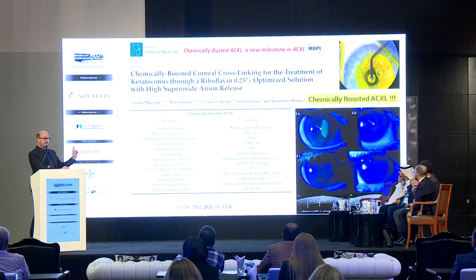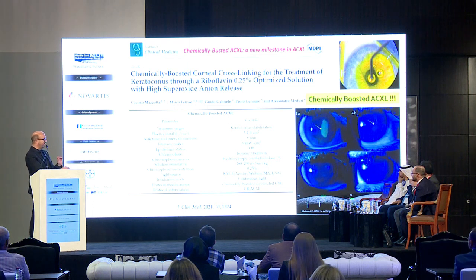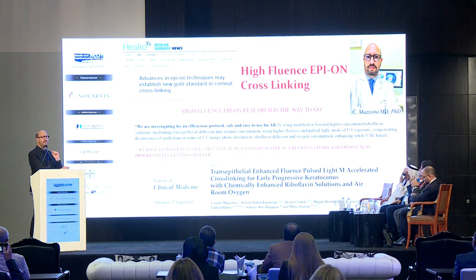Another novelty is the chemically boosted solution. In this solution, we have ethylenediamine disuccinic acid that improves the efficacy. So we can boost also from a chemical point of view with the riboflavin solution.